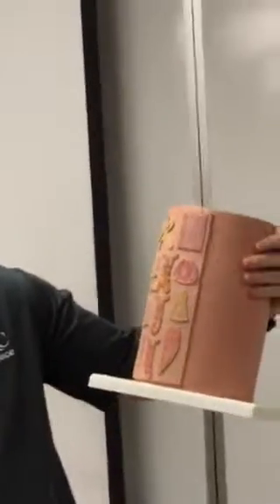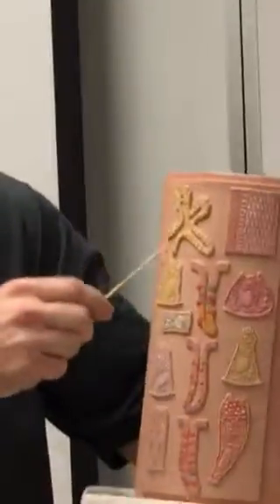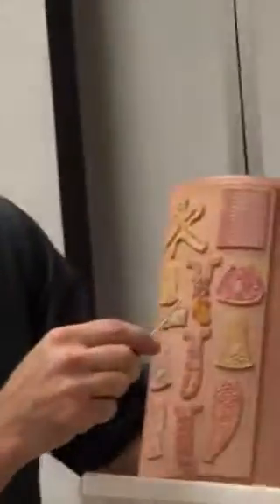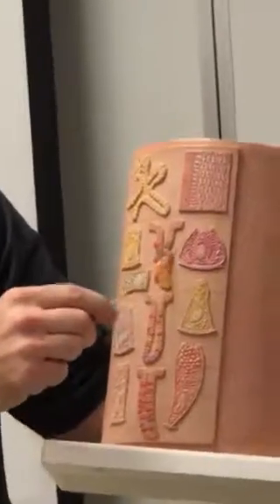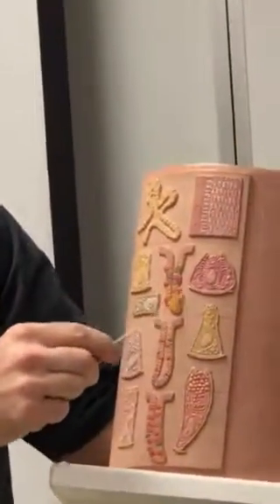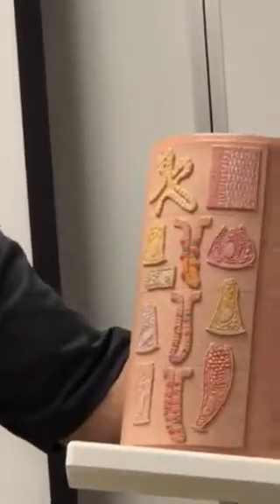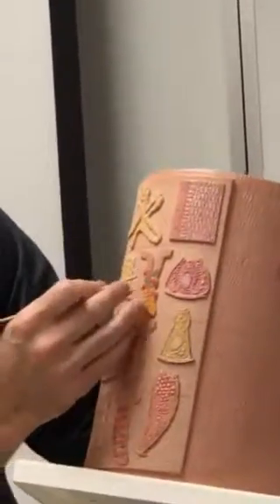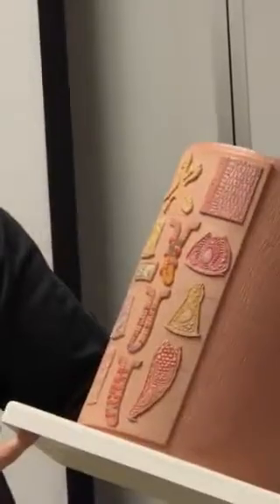And then they do a little microscopic anatomy on the backside here. So this gland is a submucosal or esophageal gland. This gland, gastric gland, it's a mucosal gland. These red ones should be the parietal cells.